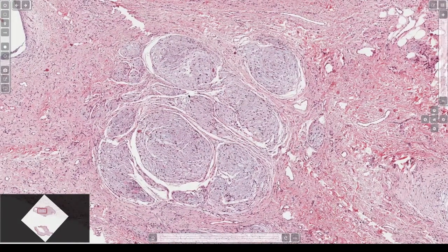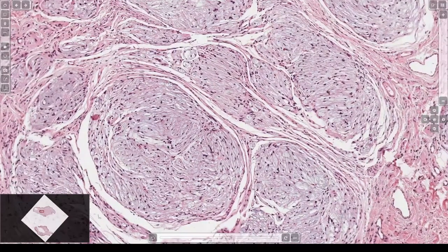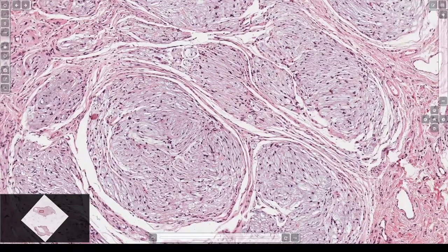I like to call these nerve sheath myxoma. That's the newer name, and I think it is less confusing. They're a myxoid proliferation of the nerve sheath, and they make multiple nodules that are hypocellular, myxoid, and have bland spindle or stellate cells that are swirling around in that myxoid background. They usually have collagen in between. The nodules are separated from each other. Sometimes they go down in the subcutaneous — multinodular.